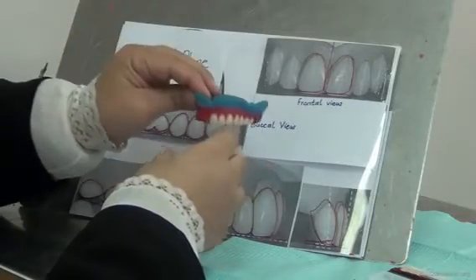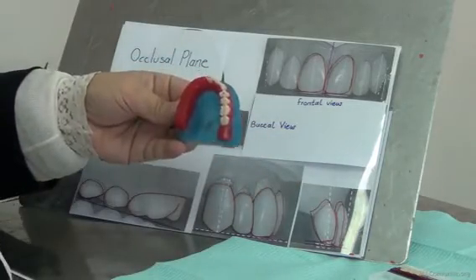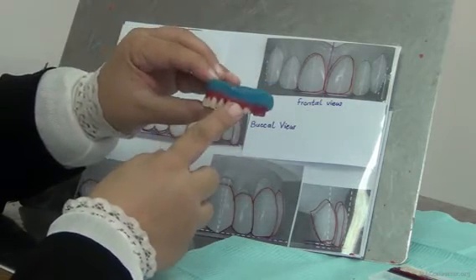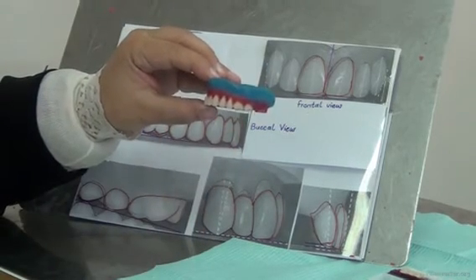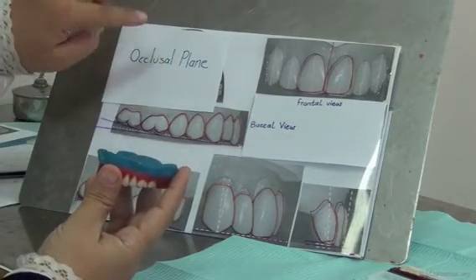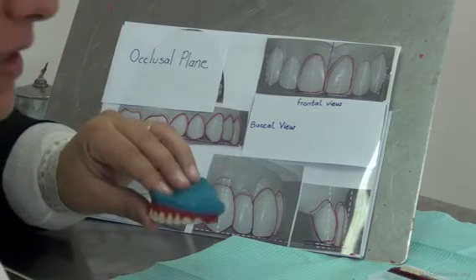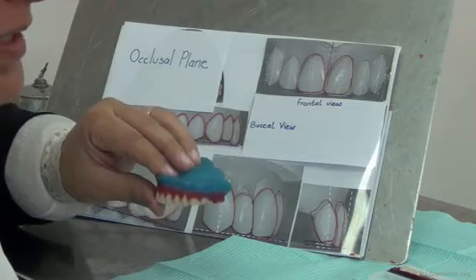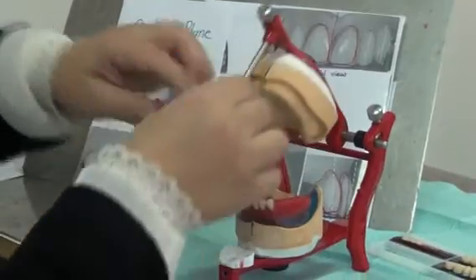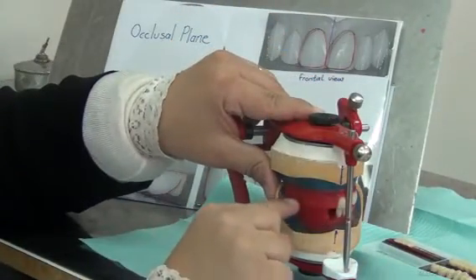So after checking the base plate on the articulator and looking at it from an occlusal view, now we're going to look at it in frontal and buccal views. So we're going to look and observe the occlusal plane. The occlusal plane is represented here on the lower articulator, if the articulator is present. The occlusal plane is the plane where the upper meets the lower. Okay, so this line is called the occlusal plane.